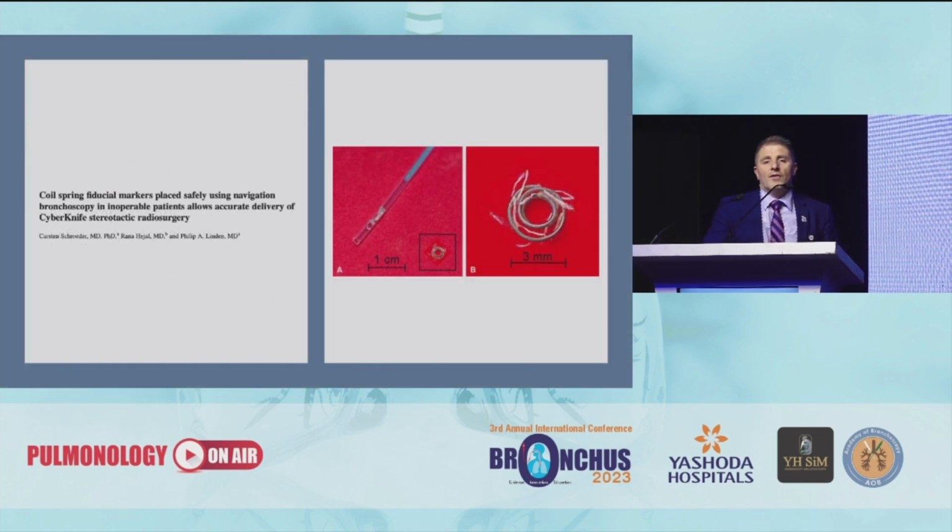In other literature, for SBRT, there was use of those types of coils. The coils you see here are usually used for thromboembolic effect inside the bronchial arteries for hemoptysis cases. However, the idea is to have those feathers around the coils. In this study they used the Boston Scientific 1 by 5 millimeter coil, and, as you see, also used the cytology brush to load the coil inside it. Those were done in 2010, ten years ago, and placed on the nodule for the purpose of having SBRT done for the case.